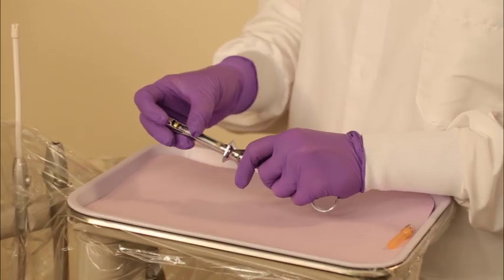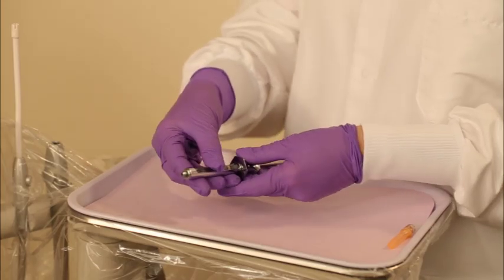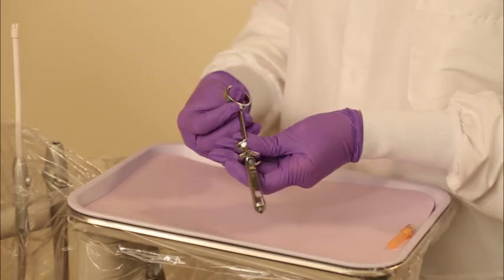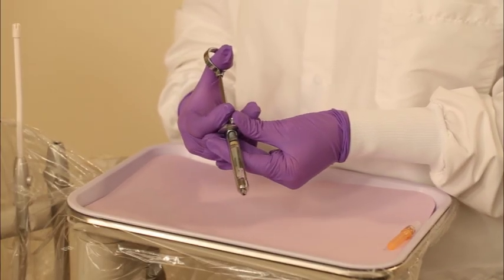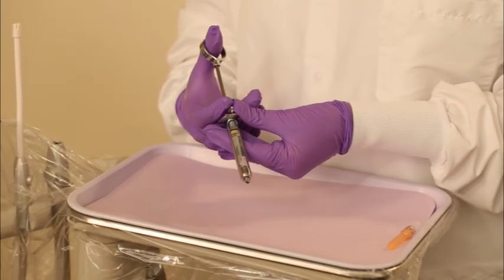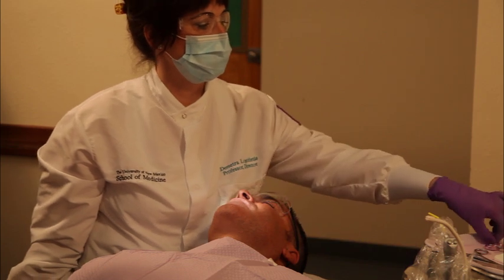Load the local anesthetic syringe as demonstrated in the procedure, loading the metallic or plastic cartridge type syringe. Before injection, follow all steps as demonstrated in the procedure, basic injection technique. Assume the correct operator position: for a right-handed clinician, 8 to 9 o'clock, right side, or 11 o'clock, left side, and for a left-handed clinician, 4 to 3 o'clock, right side, or 1 o'clock, left side.